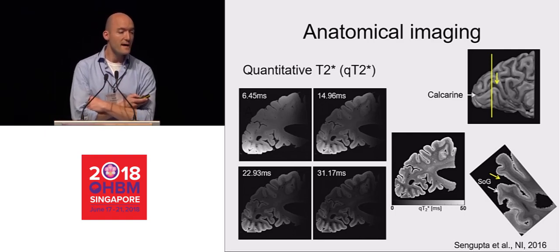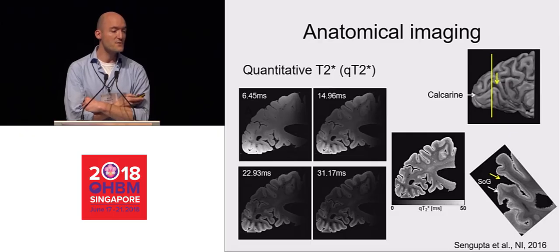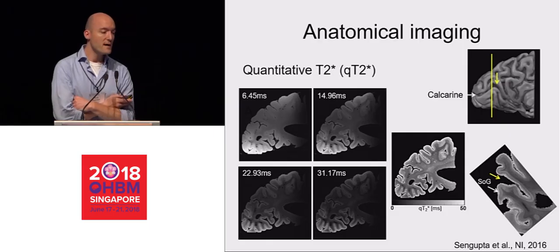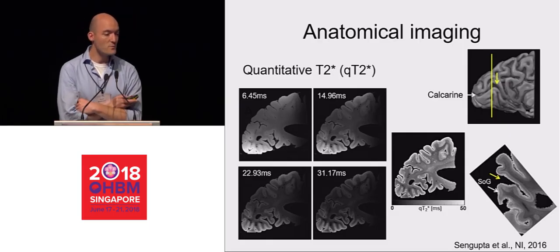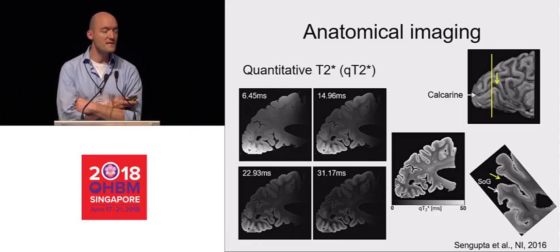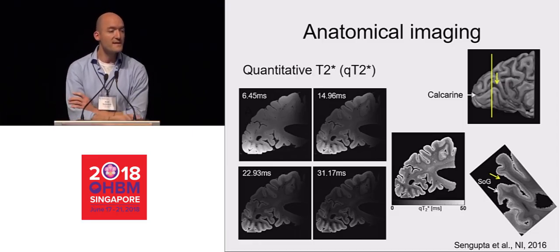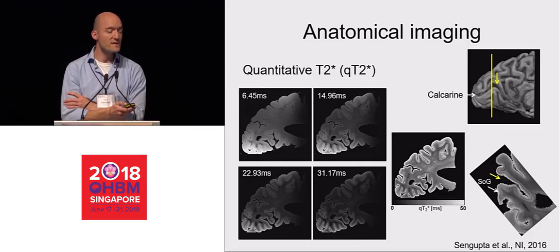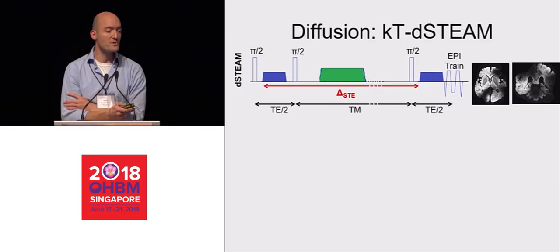and myelin. And if we take here a slice through the calcarine sulcus, indicated by the yellow arrow here, I hope you can appreciate on the projection that round and about at the white arrow there, you can appreciate the stria of Gennari that I'll indicate with SOG, so we can actually find exactly where V1 begins and ends in our tissue samples. And so we decided to combine this with diffusion imaging.